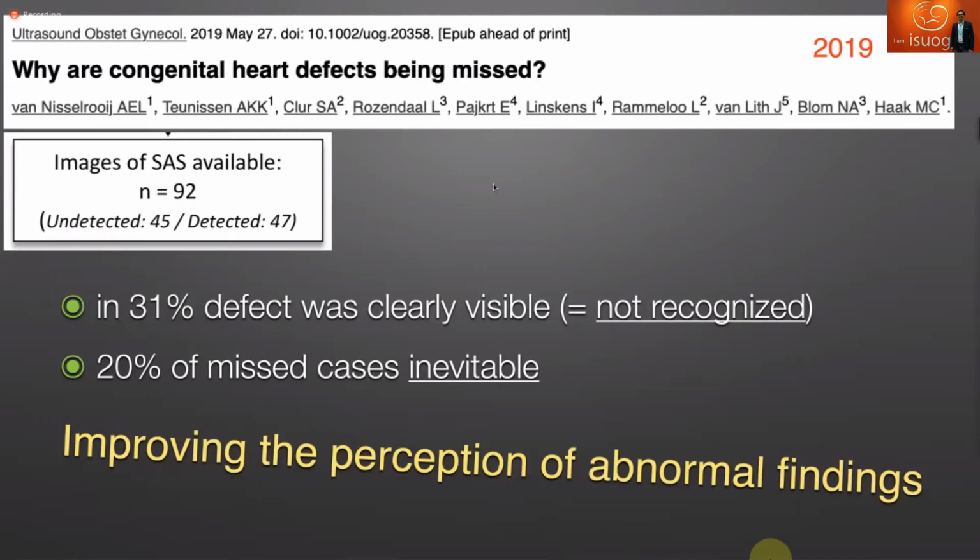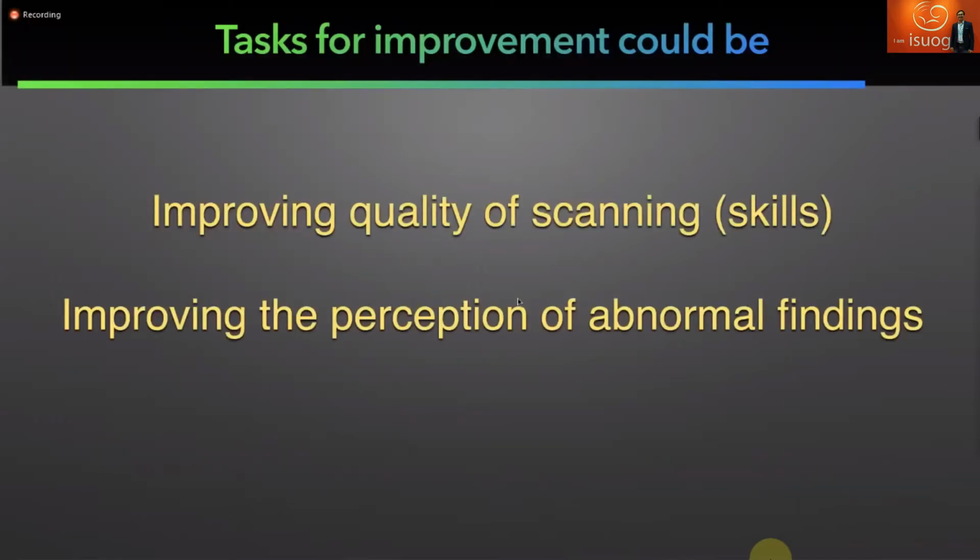So in other words, today in my talk, I will be focusing on one part, how to improve the image quality, and second, on how to improve perception, because I will show you the abnormal cases.